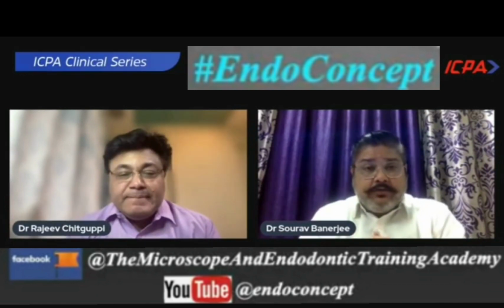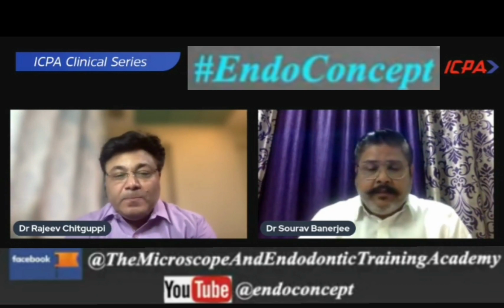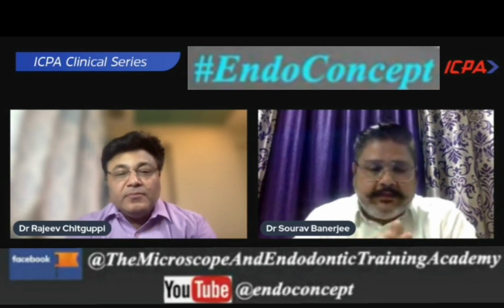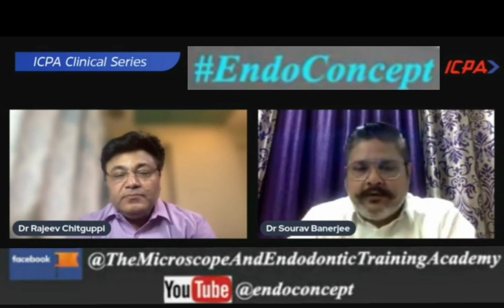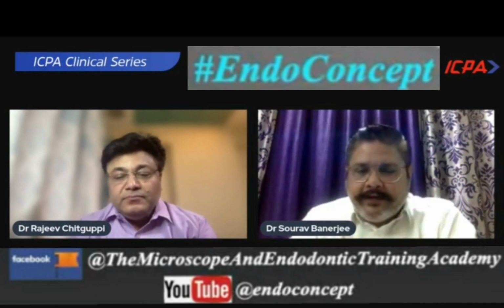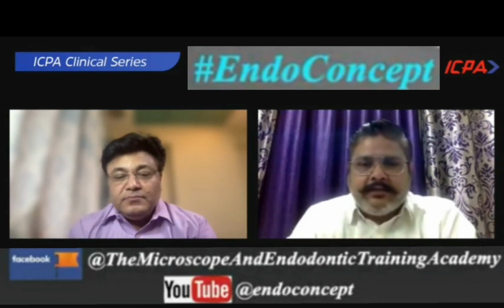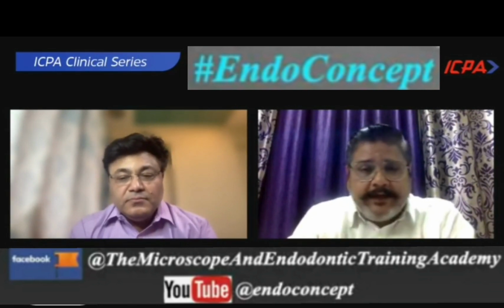When it comes to calcified canals, operating microscope is very helpful actually. Because in calcified canals, we know that the calcification happens mostly in the coronal part of the canal. The rest of the apical canal is mostly patent. But to locate the orifice is very important. So if we have microscope, it helps us in many ways.